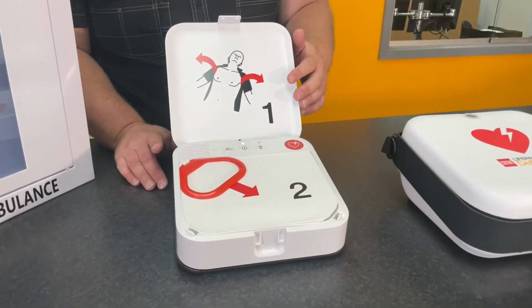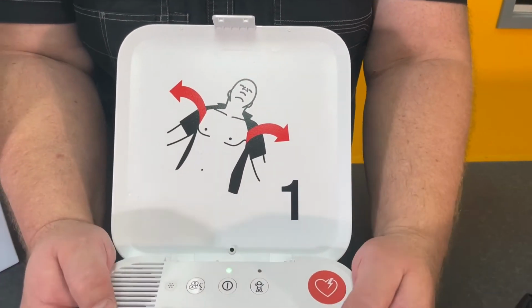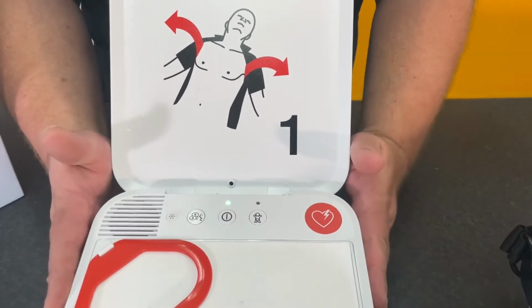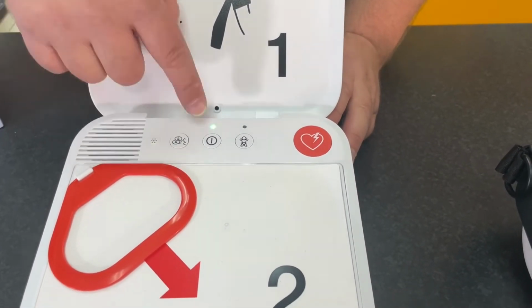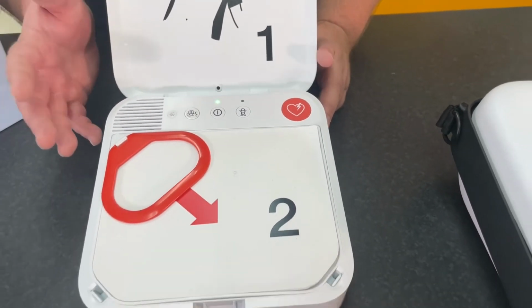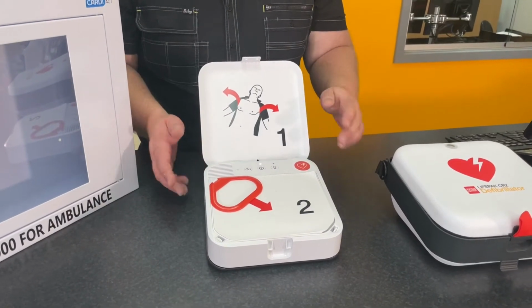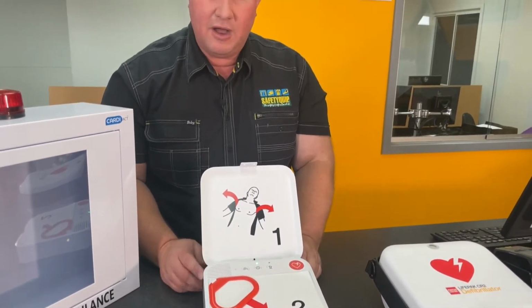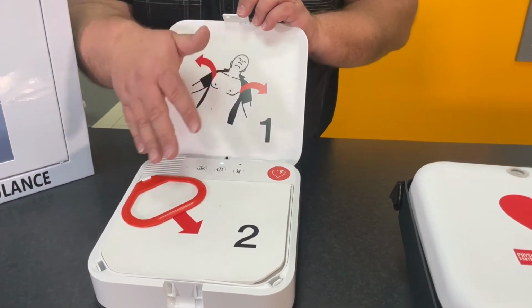So that's powered up already. If you listened carefully there, that said adult mode. So what that's saying is I've set this one up as a default for an adult. This same unit can be used on a child. If I want to use it on a child, so roughly a child that's under 8 years of age, I would simply press the child button there, and I've told the unit that I'm dealing with a child, and if it gets to the point where it needs to deliver a charge to the child, it will do that at a lower power level. What I like about it is it's very clear pictorially what to do.